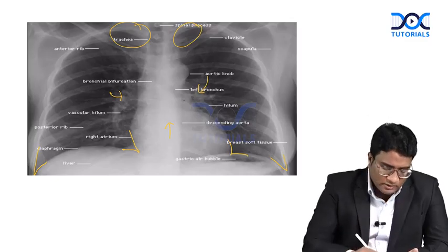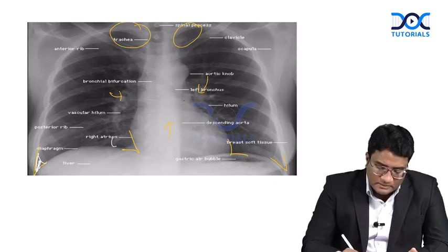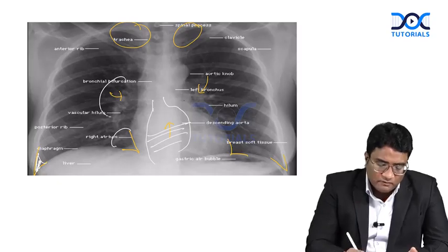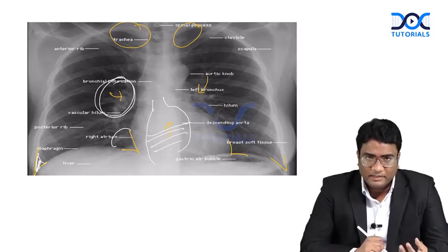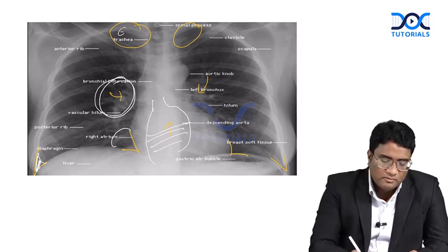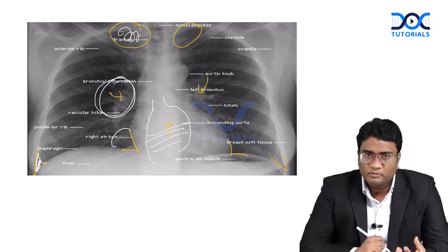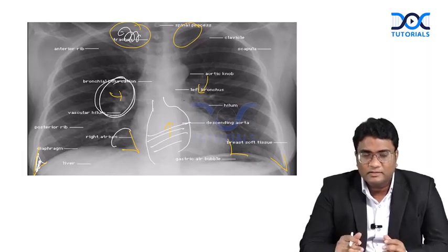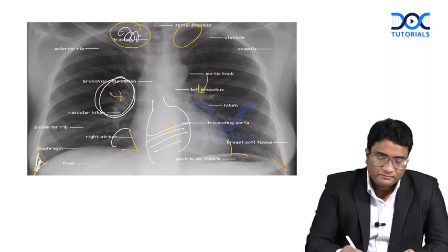You may be missing out on a small effusion there, blunting of CP angle. You may be seeing a small paracardiac mass. There could be a retrocardiac air fluid level in hiatal hernia patients. You may be confusing whether it is a hilar mass or a prominent pulmonary artery. Or you may be missing a Pancoast tumor or a tuberculous foci in your patients behind the clavicle. So try to look at these areas again. These are your hidden areas or review areas of chest radiograph.